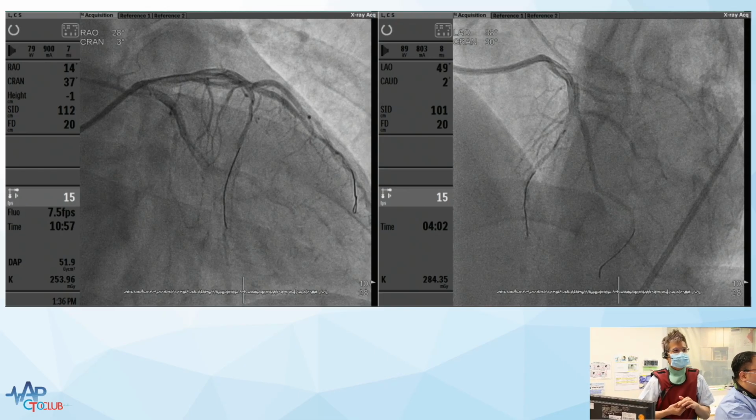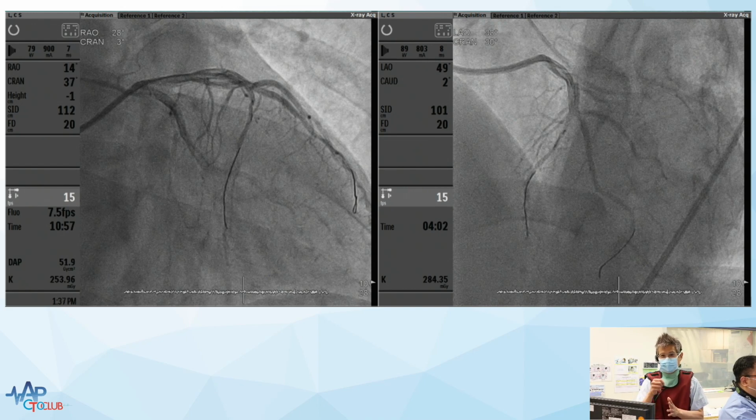But I think I've been thinking more and more about 3D wiring. And I still think there's a good chance I can get antegrade. And now with the retrograde marker, I can get 3D wiring and get antegrade through. In which case, I can use the same guide, get an antegrade, 3D wiring down to the distal, swap it out, get rid of the retrograde system, and carry on. So I think that may be the most efficient and safest way to do it.